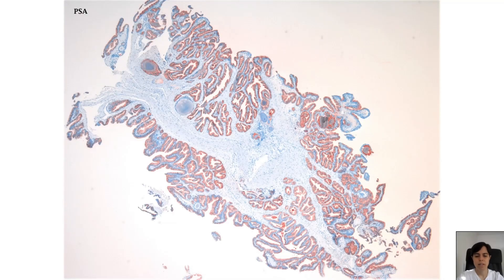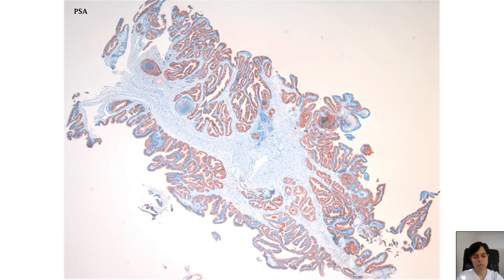Let's see some stains. PSA, or NKX3.1 if you prefer, will beautifully highlight the prostatic nature of the epithelium lining these lesions. But actually, you don't need to perform stains on this lesion — this is a purely histomorphological diagnosis. Stains were done in this case just for illustrative purposes. But if you do perform them, PSA will nicely highlight the luminal cells of the prostatic epithelium.